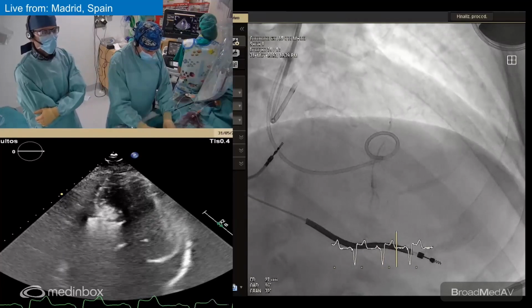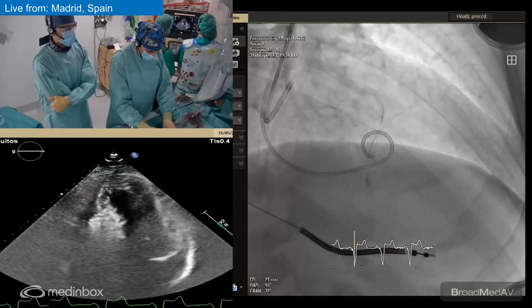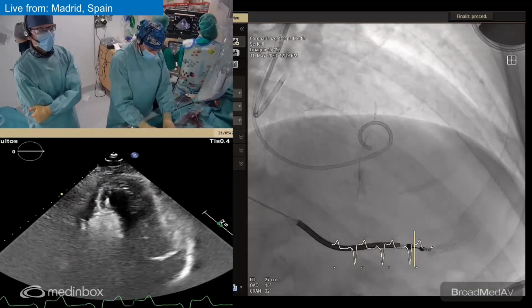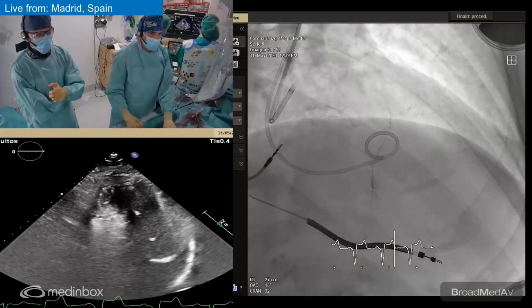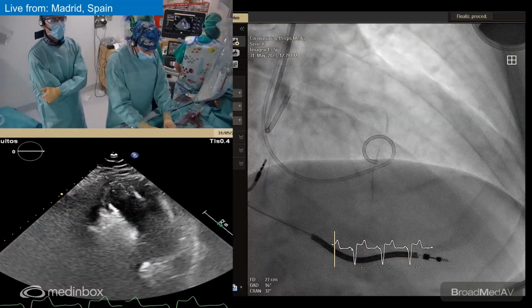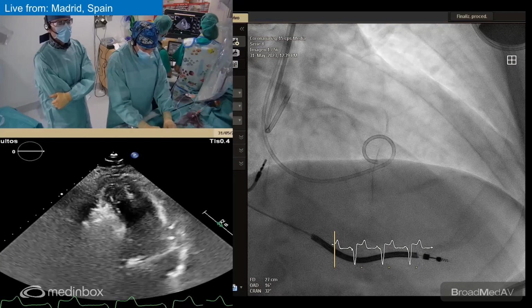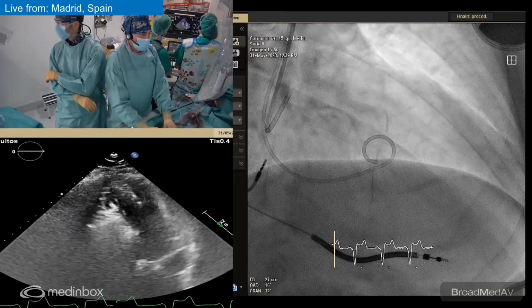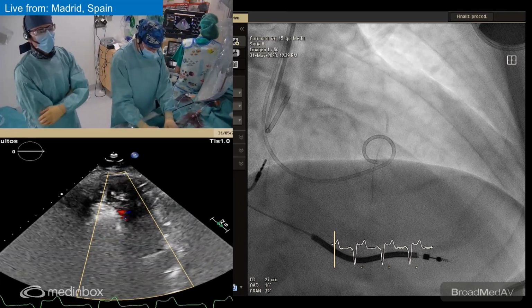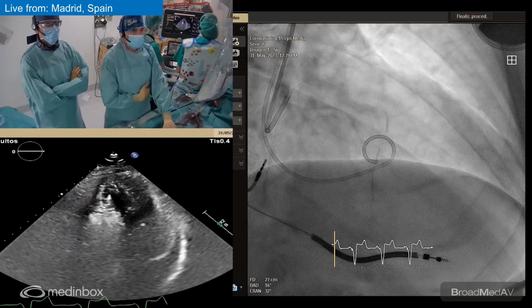We are injecting very slowly. 1 cc more of alcohol here in this branch. Very, very slowly. And remember, just start your chronometer at the last injection, not on the initial one of alcohol, to maintain the balloon inflated 10 minutes more. Put more fentanyl in. Juan Luis, how are you doing? Chest pain, no? We're administering fentanyl before every injection of alcohol.